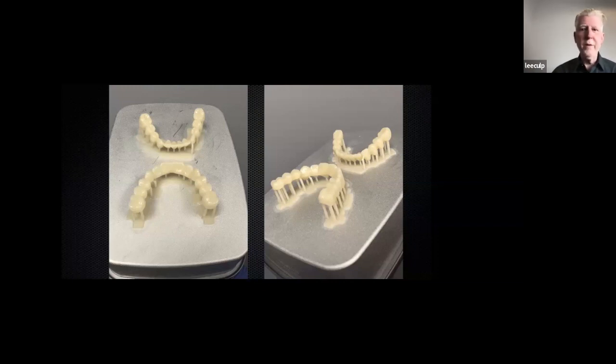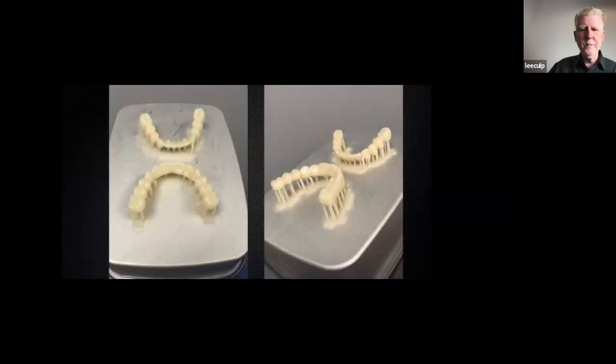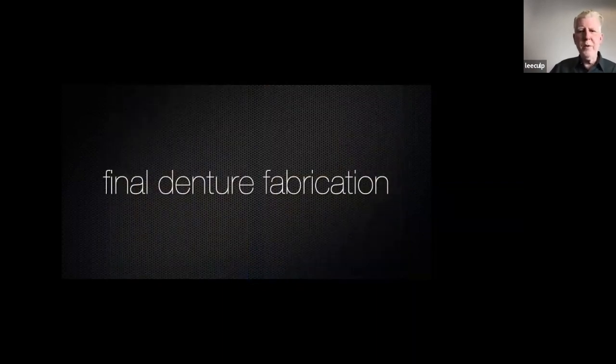It's the worst material aesthetically that has ever been on the market, and the Dentures people are really, really nice, and they think it's the best thing that's ever been created in dentistry. It was really bad, and I'll show you why. We print the teeth in a bridge, we print the base, and then we snap off the supports and put them all together and try it in the mouth.